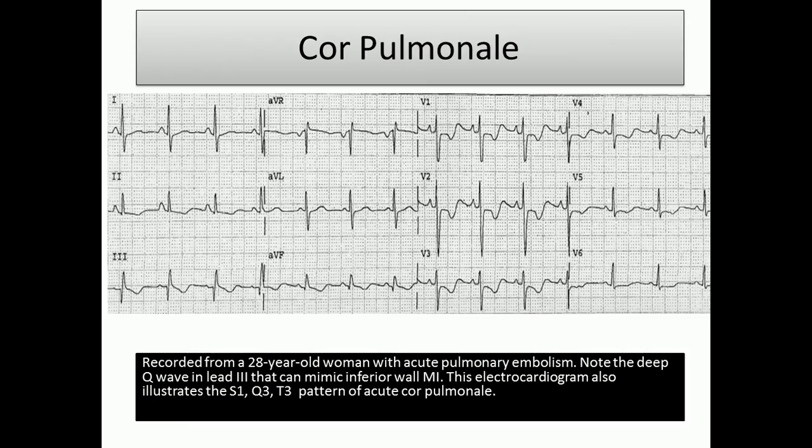As you see here, in a cor pulmonale patient, we normally have Q wave in the inferior wall without myocardial infarction of the inferior wall. We have a strain pattern of pressure overload of the right side of the heart, due to right ventricular and right atrium hypertrophy, that will produce ST segment depression. That is normally an indicator of posterior wall myocardial infarction, but it is not a posterior wall myocardial infarction. It is a normal phenomenon in the cor pulmonale patient.